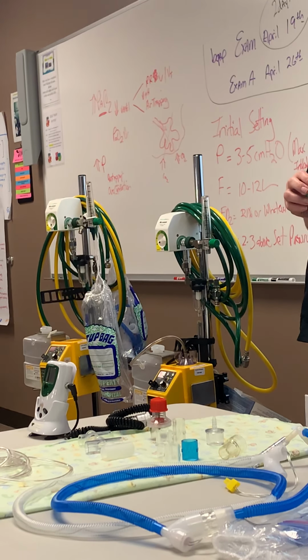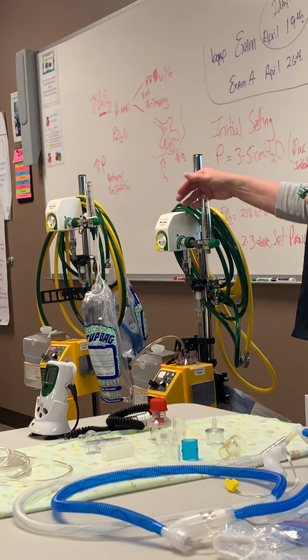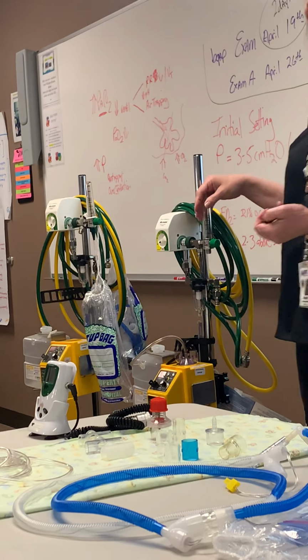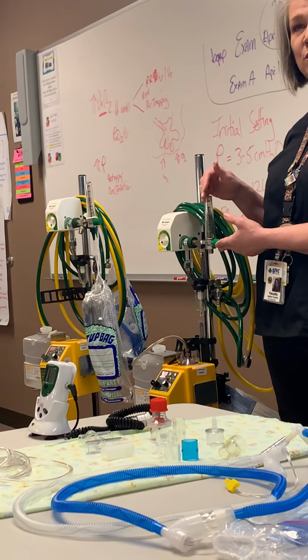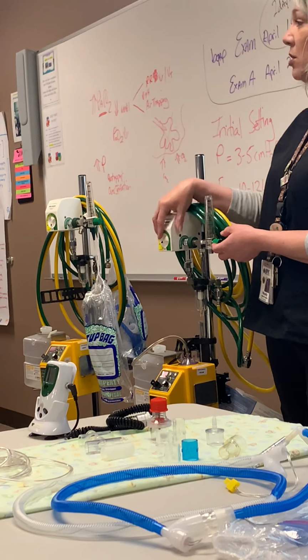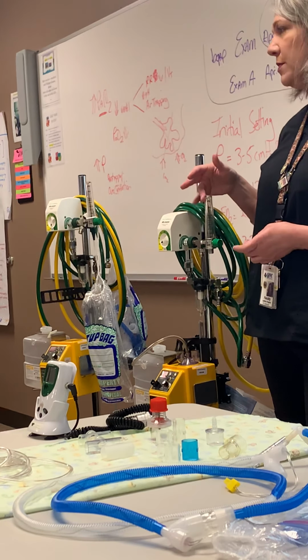Perfect. That's the beautiful thing about using the flow meter. This is strictly as its name implies. It's flow. Now it's different on adults because we don't have this interface dilution. It's straight oxygen from the flow meter.